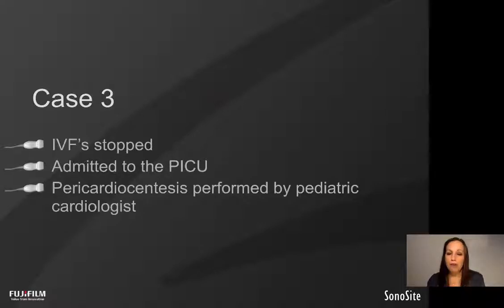The etiology was probably viral. None of the cultures grew out, and it was not a malignant effusion. But it is important to remember that this actually can happen in pediatric patients. And I wonder how many patients were actually missing pericardial effusions because we're actually just not looking.